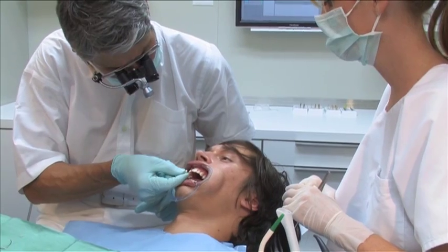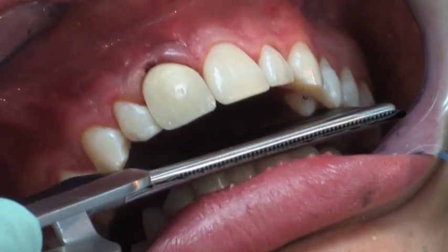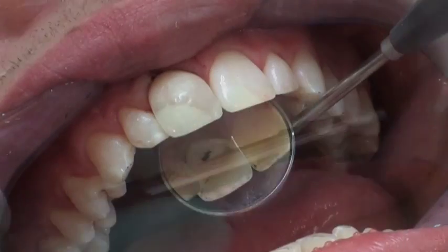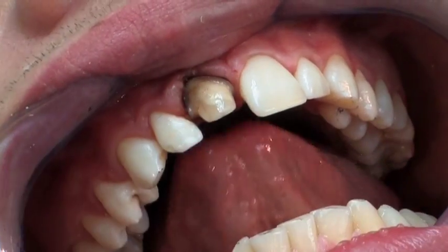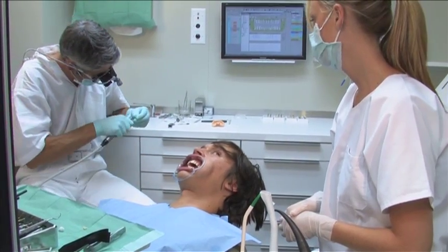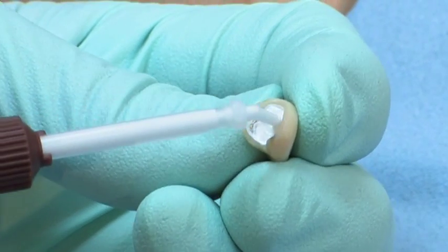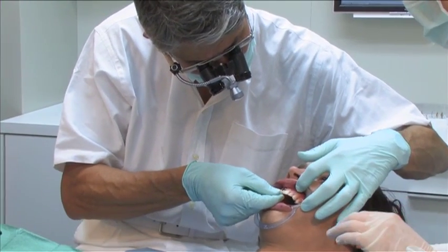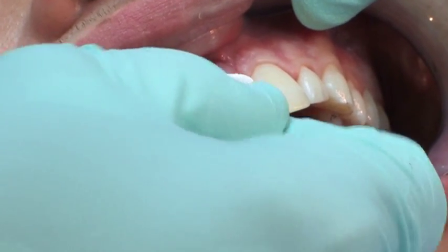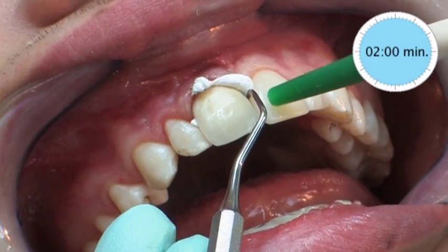The inhibition layer is removed using alcohol. Excess material is removed afterwards using rotary instrumentation. The occlusion is checked and all unnecessary contact points are removed completely. The completed provisional crown is cemented using Temposil 2, a radiopaque temporary cement based on an addition reaction silicone. After a short setting time, excess material is removed.